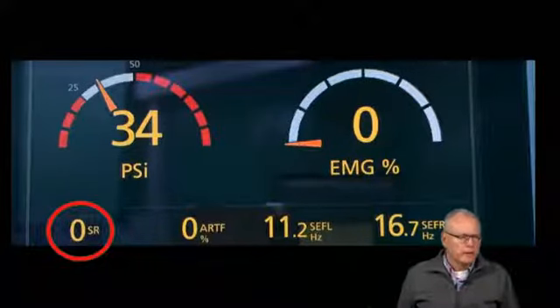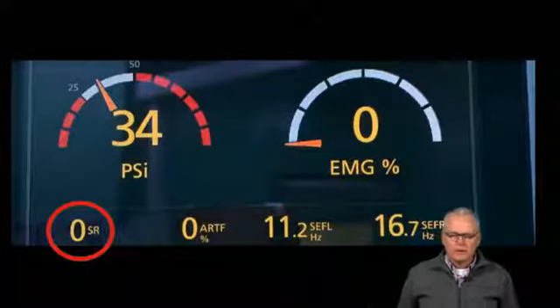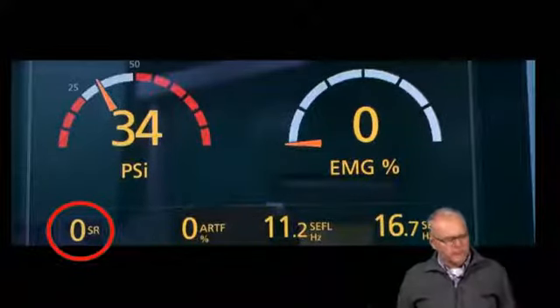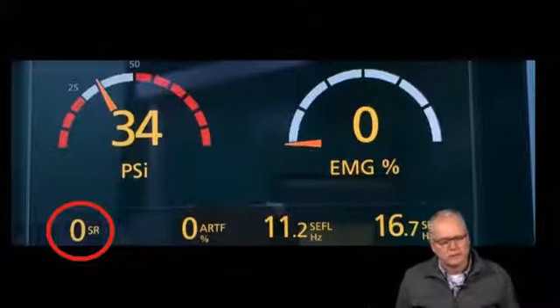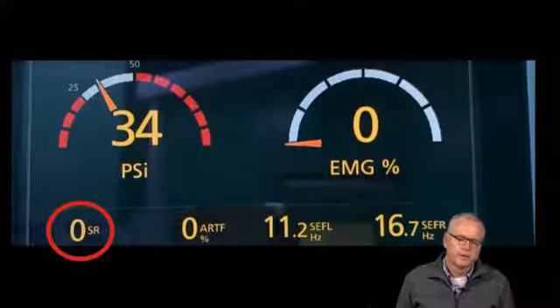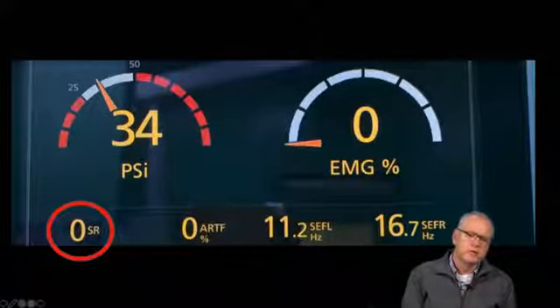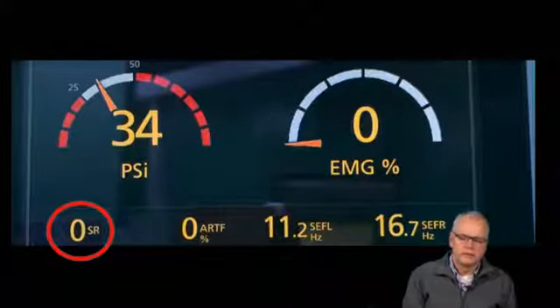And they usually require 15 to 30 seconds to calculate. And so there is a lag time. And that lag time can sometimes be clinically evident, especially during times when an anesthetic is changing quickly, for example, during induction and emergence. But in near steady state conditions, they can be a useful tool to summarize what's been going on in the raw EEG.